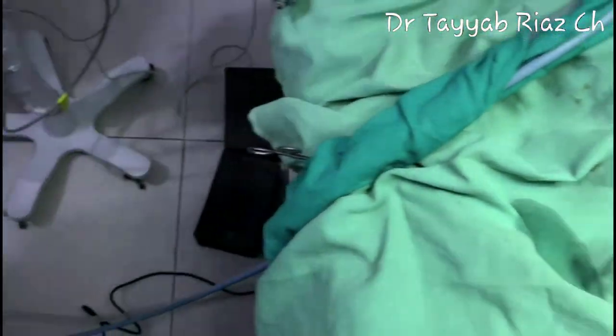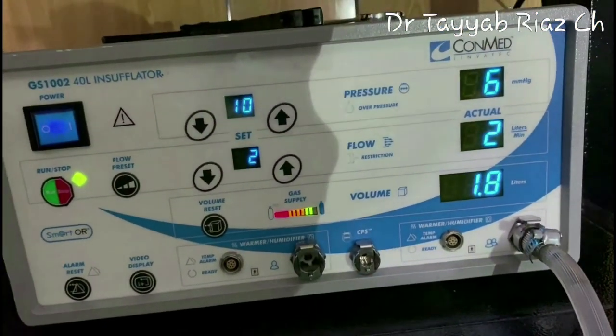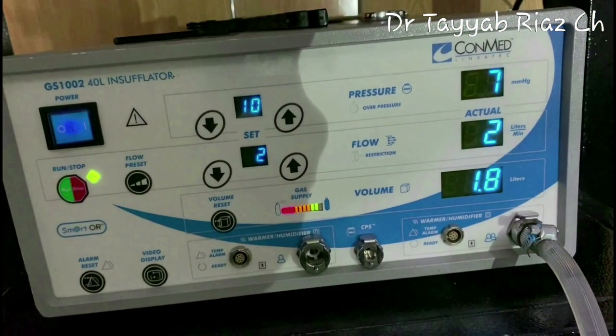This is a patient where I am insufflating the carbon dioxide, and if we look at these indicators, I have set the preset pressure at 10 mm of mercury, and it should always be kept at 10 in patients 12 years of age and onwards. And after the Veress job is over, on cannula insufflation, it can be increased up to 15 mm of mercury. But up to 8 mm of mercury in pediatric patients and for diagnostic laparoscopy, and 18 for bariatric procedures.